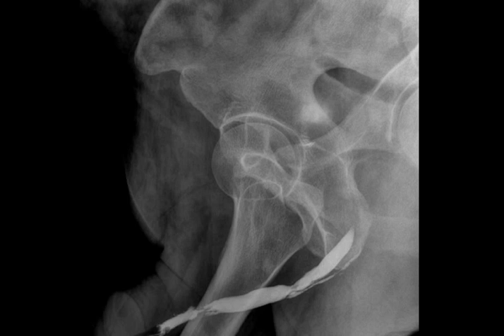In the urethra, if you push 300 cc's, it will not finish. In order to push like 20 or 30 cc, you need a long time and patience. Calm down, take a deep breath, it's a very delicate procedure. For example, with trauma, we only see the anterior, we don't see the posterior.